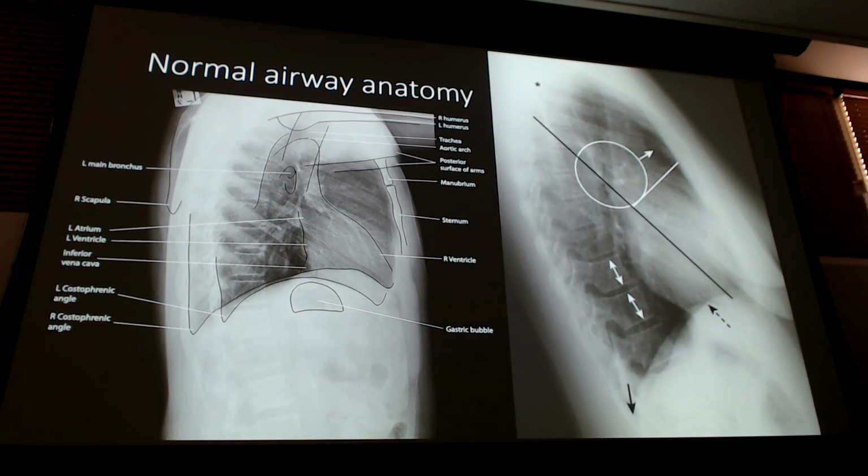But later on, when we get into pneumonias or consolidations, if I have a large area of fluid sitting in this lower lobe of the lung, one of the signs of it being there might be that all of a sudden these vertebrae are more radio-opaque than the ones above it, because there's a layer of fluid laying over it in the lung. It's not here, but you'll see when we get there. But in order to understand that, you need to know first that they should get darker as they go down. Why? Less soft tissue, more lung as I come down. So they should be darker.